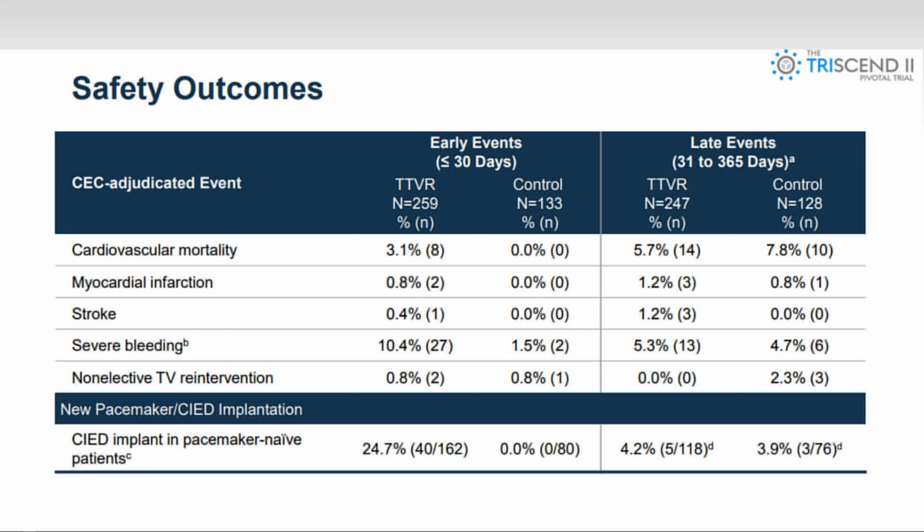And this is some of the outcomes. The mortality with the procedure at 30 days is 3%, so not as low as the 0.5%. Now you compare that to medical therapy, of course there's no procedural mortality. Out to 1 year, the mortality is about 8%. That's just showing the 6% difference, 8 to 9%. So it's not a completely benign procedure when it comes to mortality.